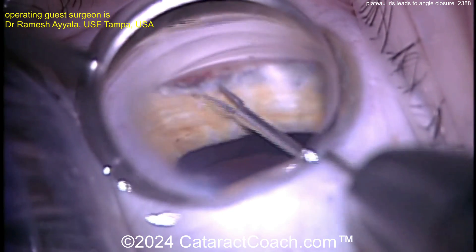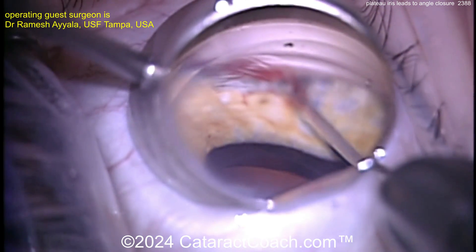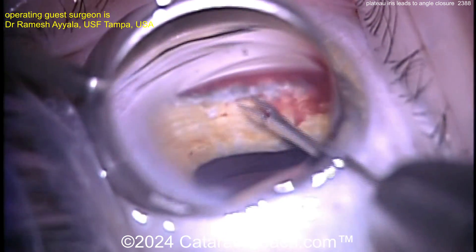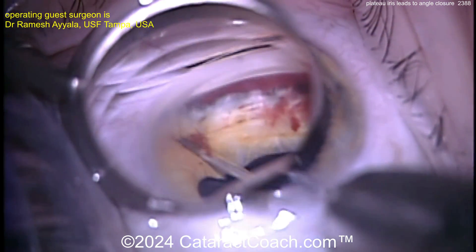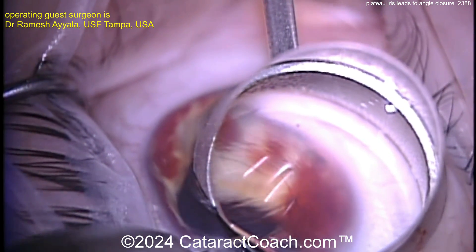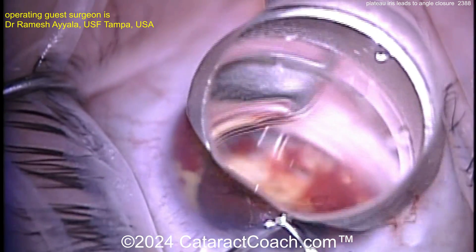He's going to now do some ECP — endocyclophotocoagulation with the diode laser. A little bit of bleeding here is pretty normal. Be careful — you can disinsert the iris if you're too forceful, so you've got to be gentle here.